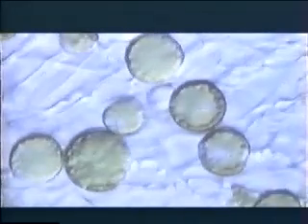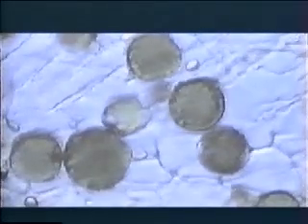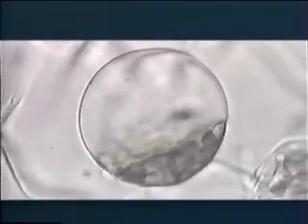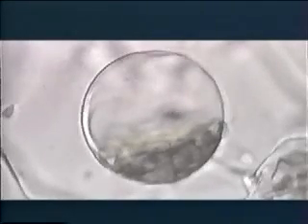At the 7 o'clock position on the screen, we see the ejection of both structural materials and bubbles from the cell through the membrane. A single cell is identified during a rapid extracellular freeze. Ice penetrates the cell with this explosive action, allowing intracellular ice to form at a much more rapid rate than in the extracellular environment.